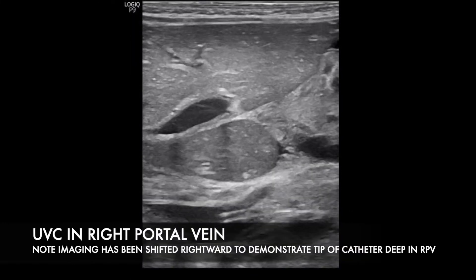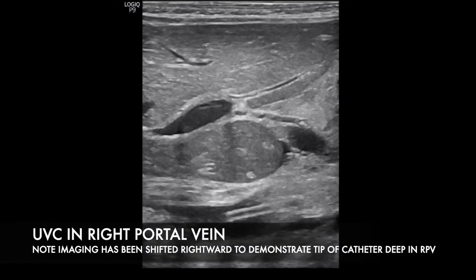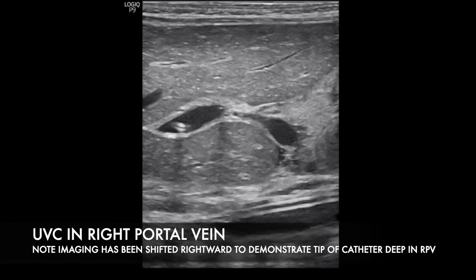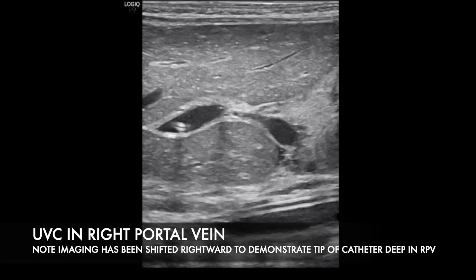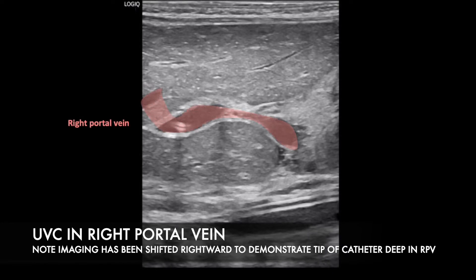This next frame shows the right portal veins deeper in the liver, with a malpositioned catheter seen within at left.